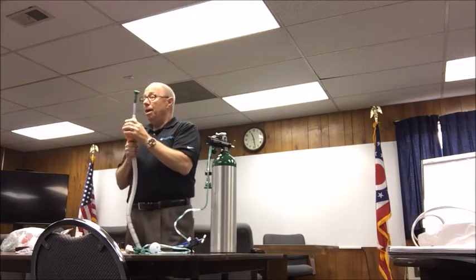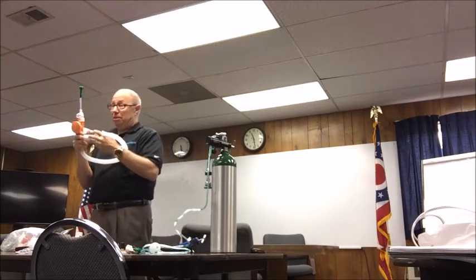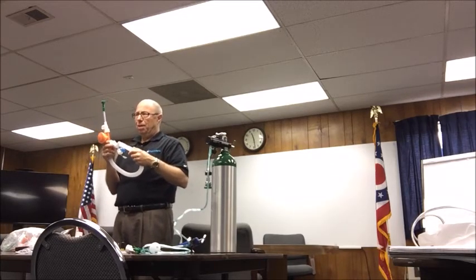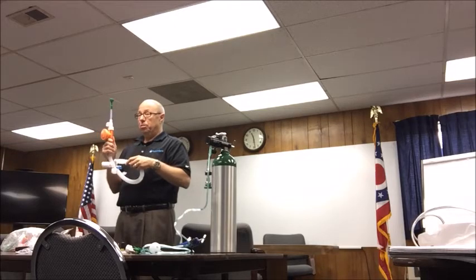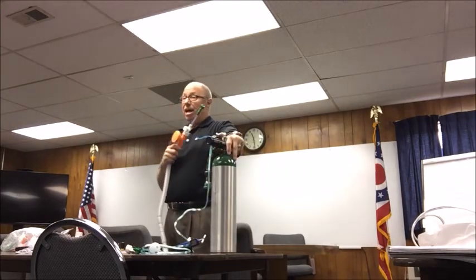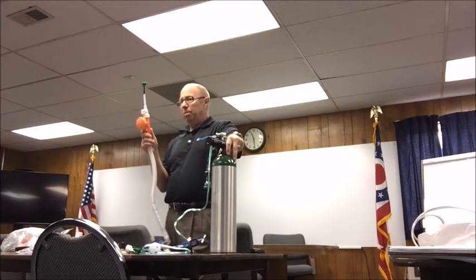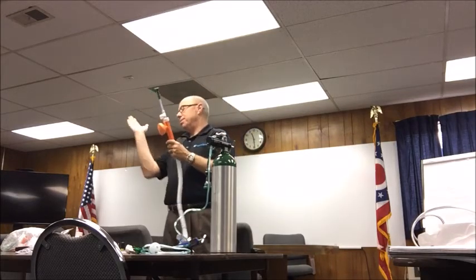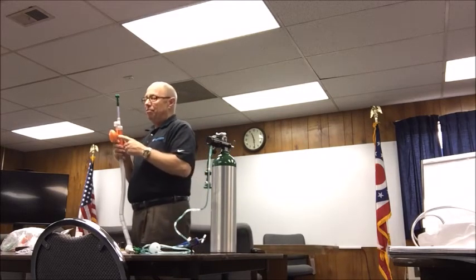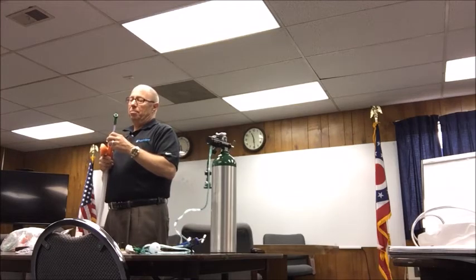Now, it's my understanding that these will be separate in the truck, because if you buy it like this, quite honestly, it's very expensive. You're not going to use them that much, I wouldn't think, but you'll have the ability to increase that. Now, I will tell you, at 90% on a full D tank, you'll blow through it in about 8 minutes. In fact, the Mayo Clinic buys it like this, and they called me about 8 months ago. He said, hey, Kent, I got a question. We ran through 8 D tanks and 450 liters of oxygen on the ambulance in about 30 minutes.